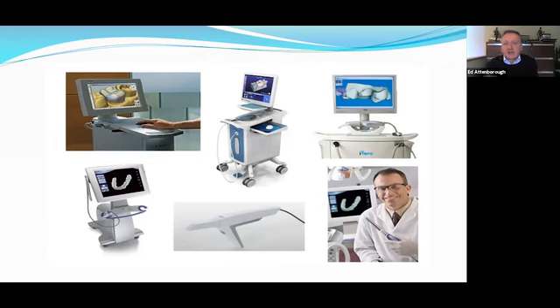As I said, exactly the same principle. Some of the scanners here have been around for quite a while. This is obviously CEREC Prime Scan from Dentsply, which originally came out in the mid-1980s. Now that system originally was a proprietary file format, so it was a closed system, a bit like VHS and Betamax years ago for video recording file formats. CEREC had its own proprietary file format that meant you were locked into a certain workflow. Same story with iTero and 3Shape and others actually.